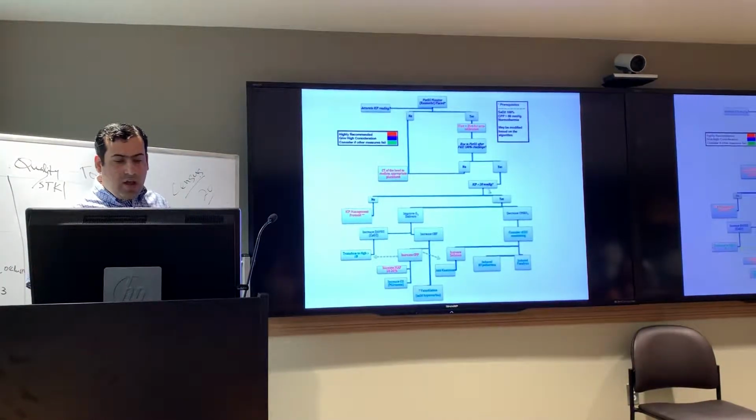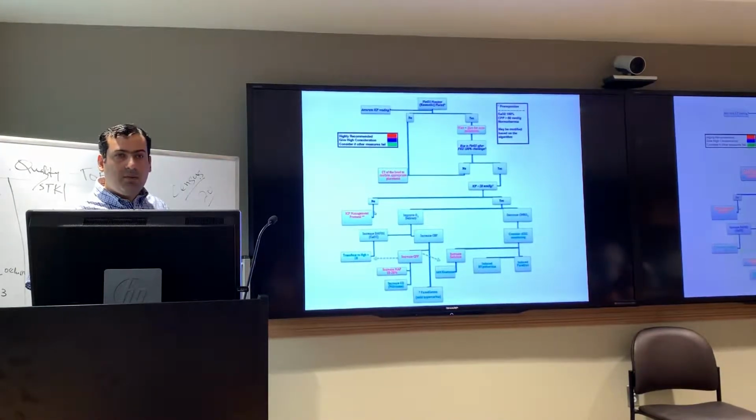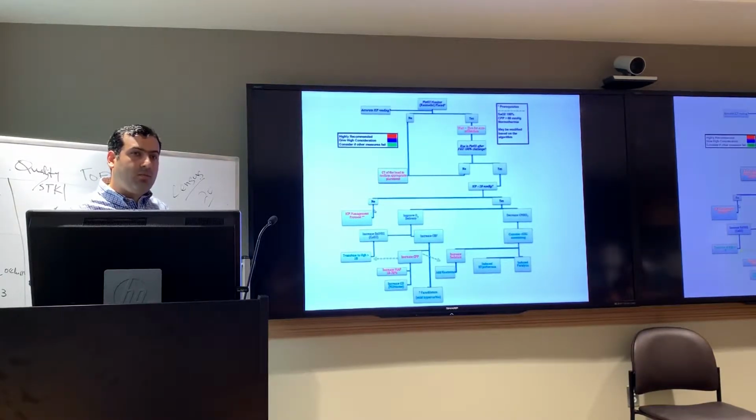And now look at the ICP. If your ICP is high, I think the best thing is to start managing ICP, because not only do you need to do that anyway, but also it will improve your PbO2, and do it first. Also, ICP management is more or less a standard of care. So you can't say that I'm not doing that because I have another thing that I need to worry about. That's the standard of care you have to deal with.